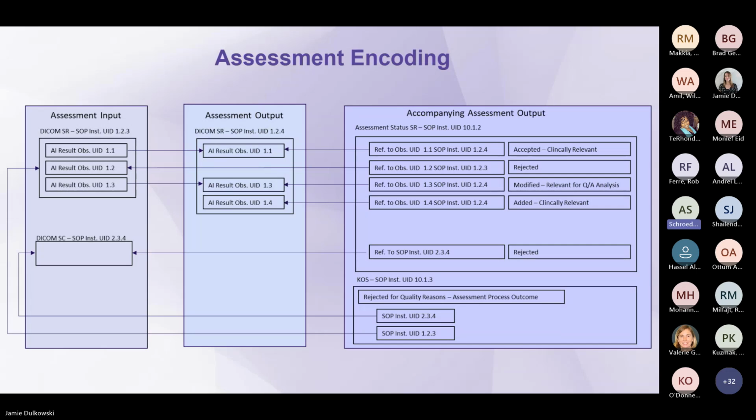And I had mentioned there's a secondary capture, which gives an overview of the 3 findings. But since there was invalid information, like the second nodule being present, which is invalid, plus there's 1 missing nodule, the aim is to completely reject that object as well.